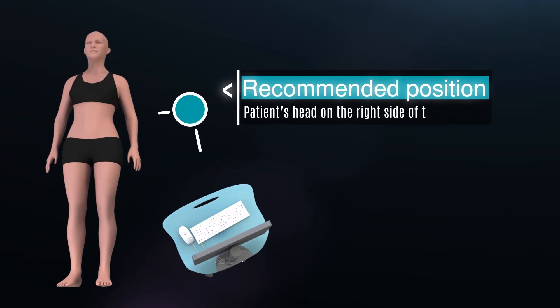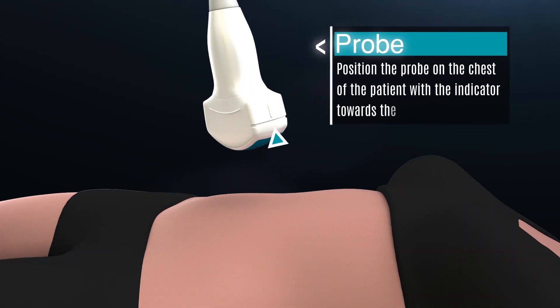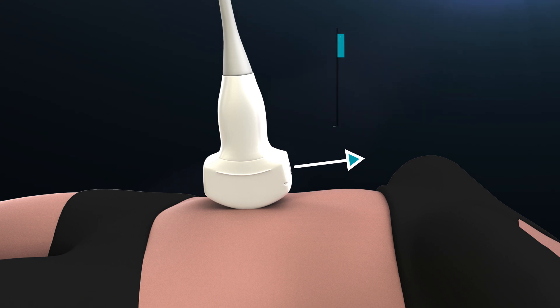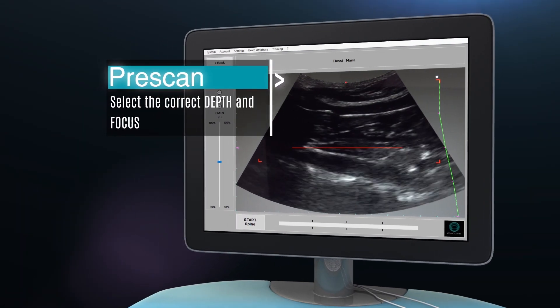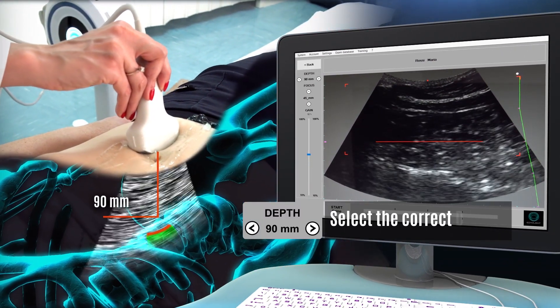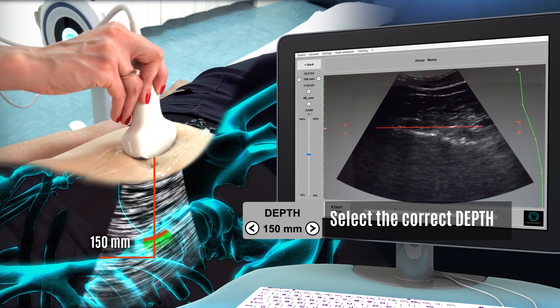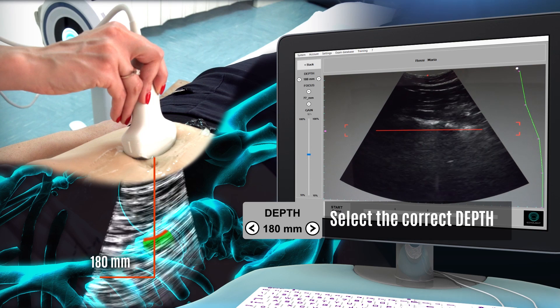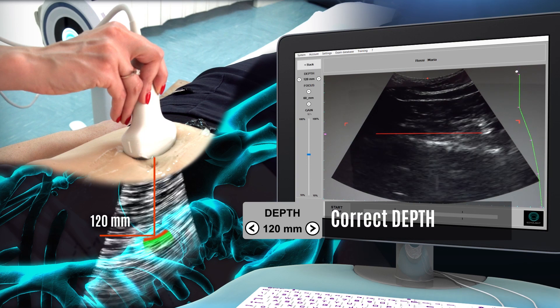Position the probe on the abdomen parallel to the spine's plane with the indicator towards the patient's face. Make a pre-scan to set the correct depth and focus. Select the depth by using the left and right tabs or by clicking on the left and right buttons on the ECOS Studio interface. Select a depth to have the bone interface of each vertebra in the center of the echographic field of view.